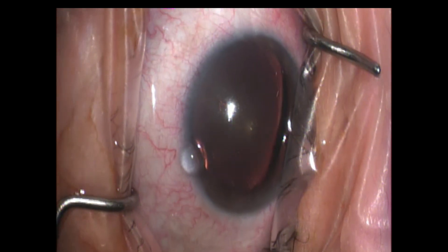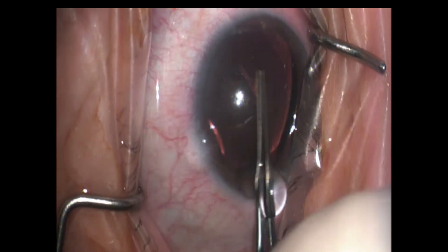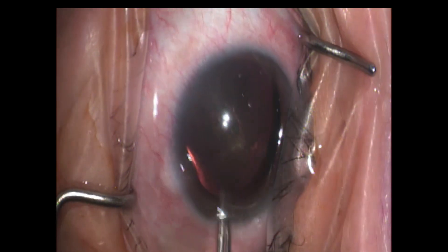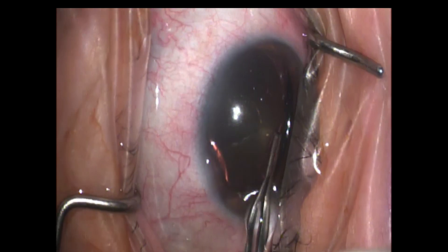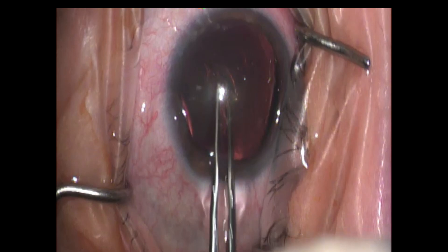Once that rhexis has started, I go in with my microutrata forceps. We're going to continue the creation of the rhexis itself, trying to go 360 degrees and creating as nice of a circle as we possibly can, free-handed.